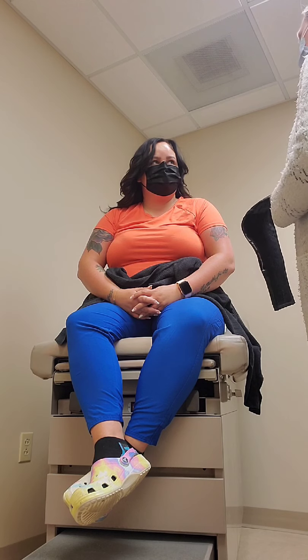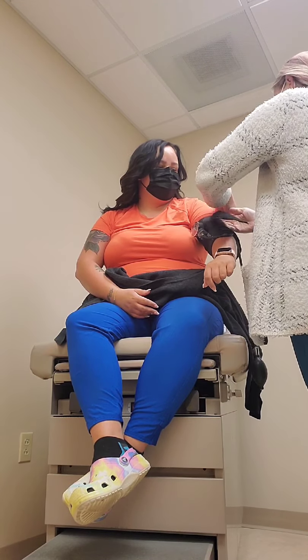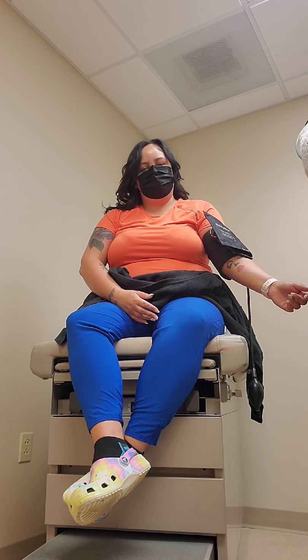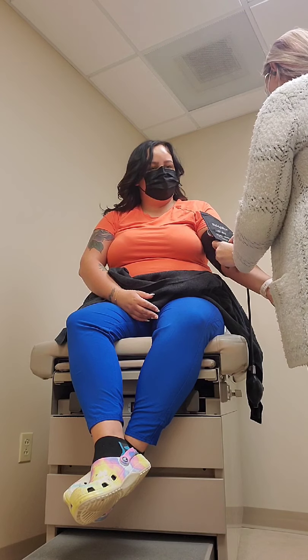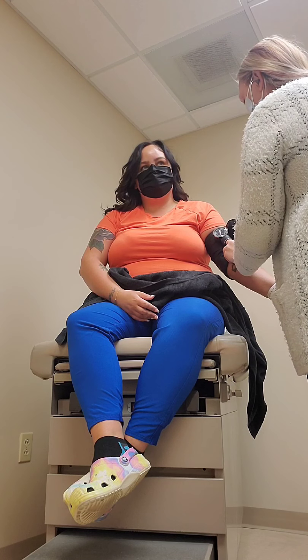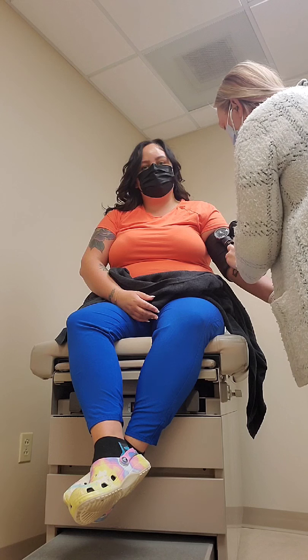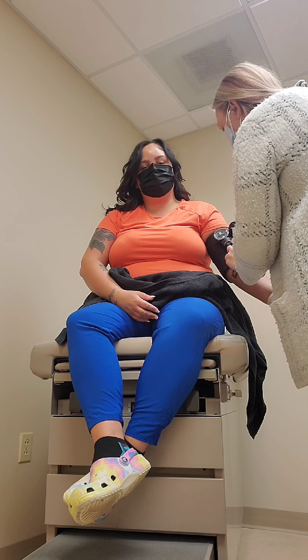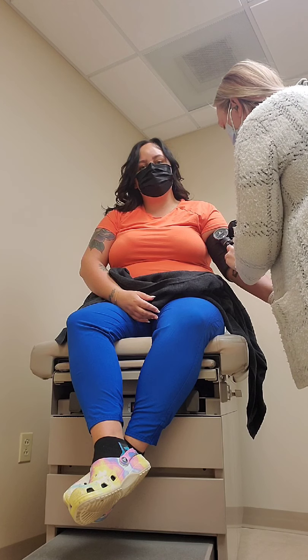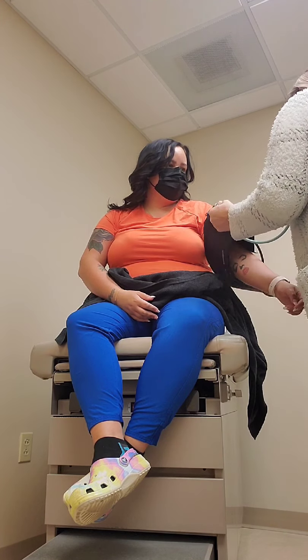All right, Miss Jackson, so the first thing I'm going to do, my name's Lisa, I'm the nurse practitioner, so I'm going to get your blood pressure. Okay, so the blood pressure is 122/70.